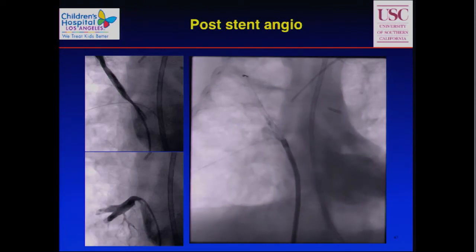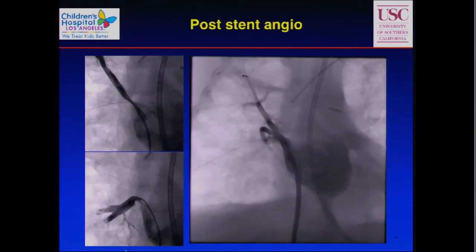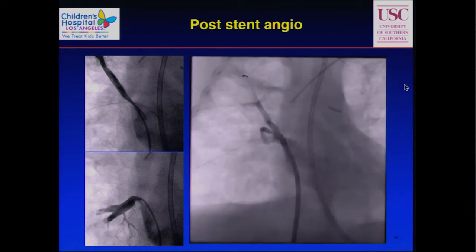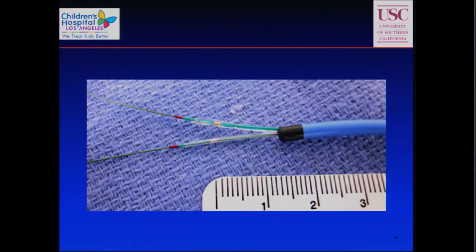So this is in the pulmonary veins. And now you see how much better flow is. This is the pre to one lobe. Here's the pre to the lower lobe. But we're able to open this up. Again, this is not a good size stent, still small, but there's 2 of them there protecting that orifice. And this is what it looks like. That 8 French can actually take through 2 of the coronary stents, and they can go up to like 4 or 5 millimeters.